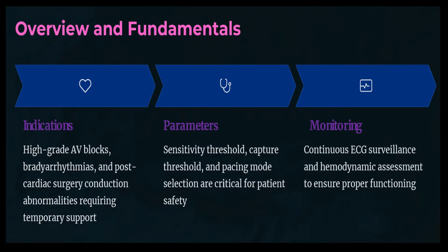These include high-grade AV block, bradycardia arrhythmias, post-cardiac surgery, and conduction abnormality, which require temporary support. The parameters involved, like sensitivity threshold, capture threshold, and pacing mode selection, are critical for patient safety. Monitoring should include continuous ECG and hemodynamic assessment to ensure proper function of the pacemaker.